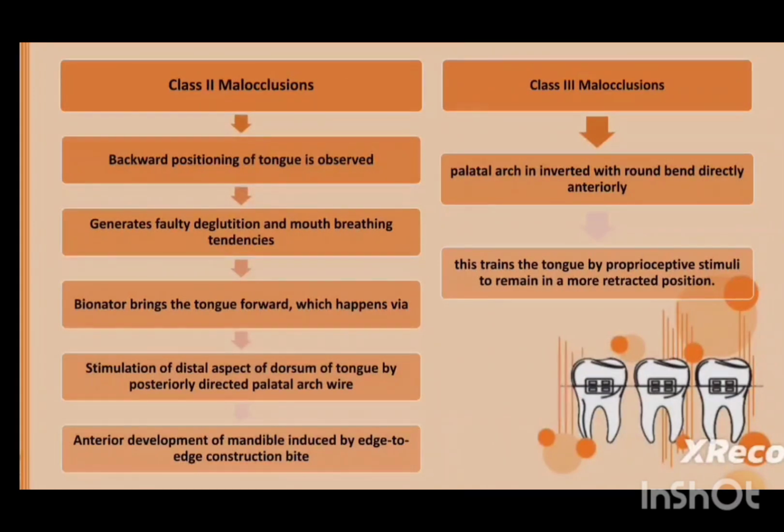The anterior development of the mandible is induced by the construction bite. Now, in class 3 cases, this palatal arch is inverted with the round bend directed anteriorly. This causes the tongue to be trained by the proprioceptive stimuli to remain in a more retracted position.